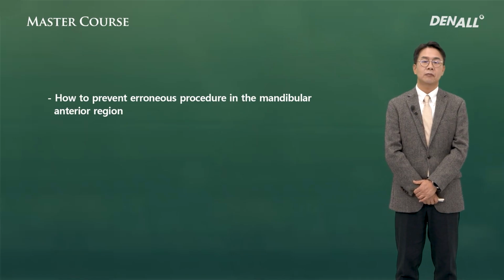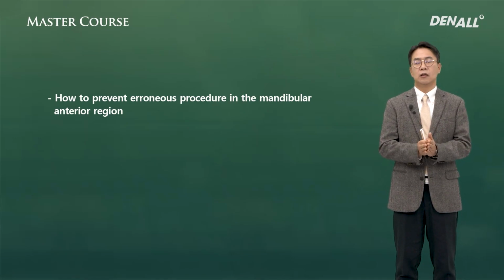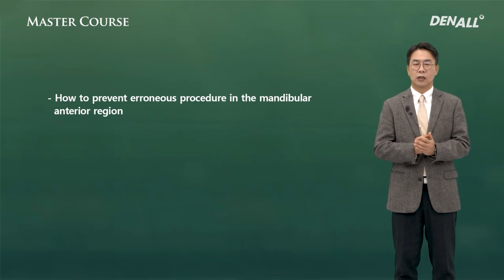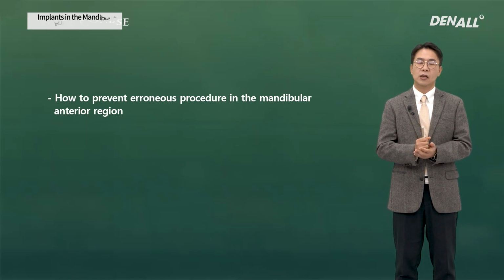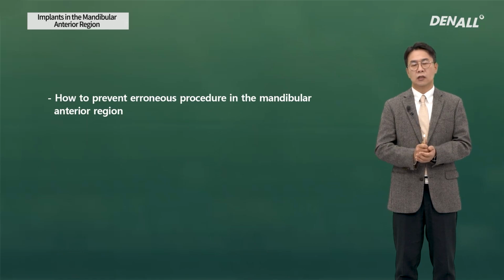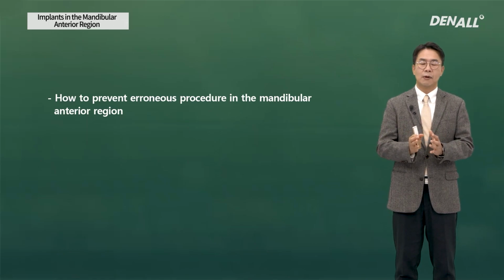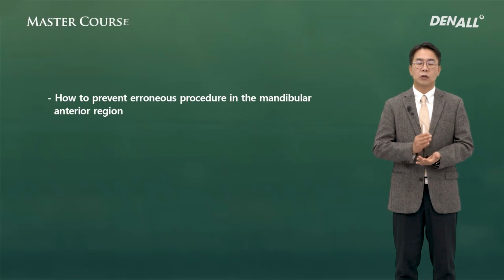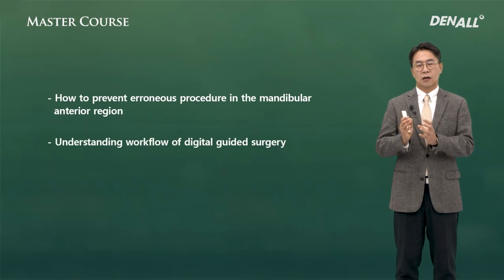Summary. The characteristics of mandibular anterior, it has very narrow ridge and concavity. Accurate drilling is very important. Drilling can have a lot of errors, so you need to understand how to reduce the errors. One of the ways to reduce the error is the guided surgery.